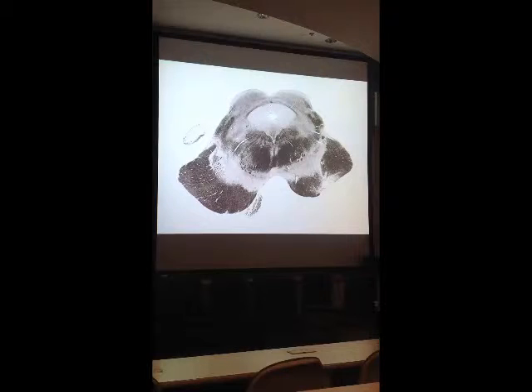So slide 24. Again, you should be able to recognize that this section on 24 represents a section through what part of the brain? Midbrain. Again, major anatomical landmarks include the cerebral aqueduct with periaqueductal gray. You can see the area here of the cerebral peduncle. I think you know by now that in the cerebral peduncle, you need to recognize this big bundle of white matter, which is all descending fibers descending out of the cerebral hemisphere.